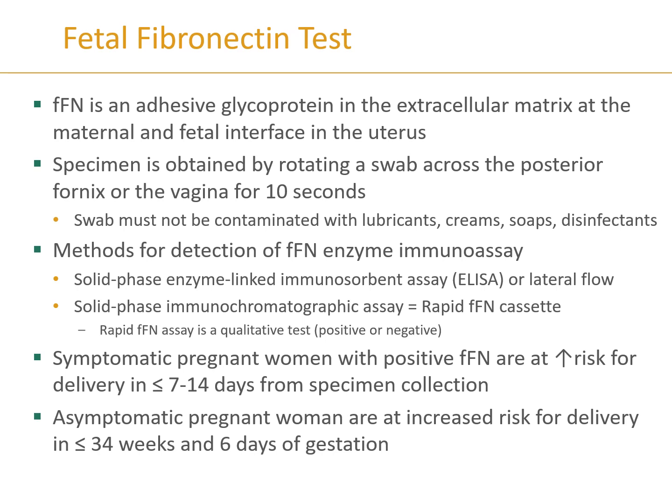The specimen, when it's collected, they collect it using a swab, of course, and there's a couple of different methods that they can do that testing. So they could use ELISA testing or lateral flow testing, or even some of the rapid kit cassette testing where they're looking for a qualitative result of positive or negative. And so once that fluid is collected, that test would be run, but that swab does need to be free of anything that could interfere with it, like lubricants or any kind of cleansing agents for the vaginal area.